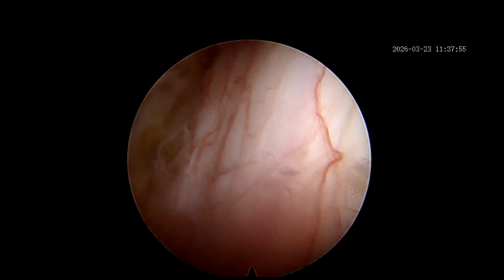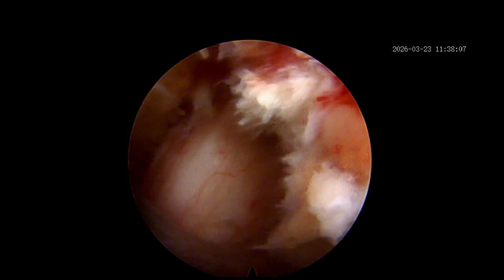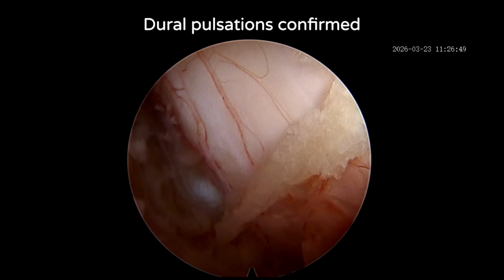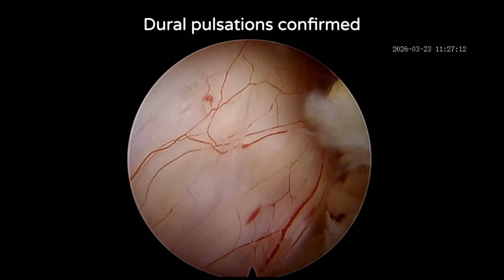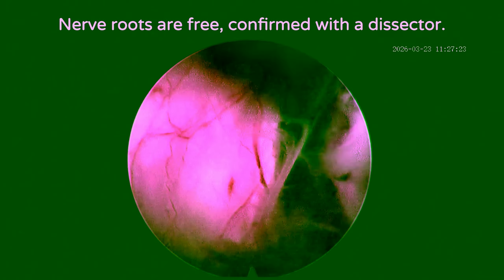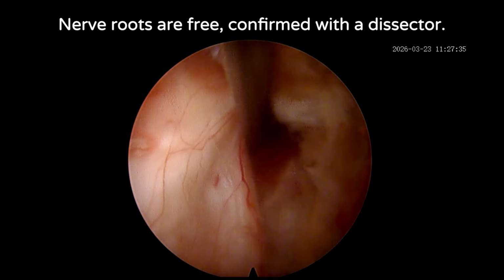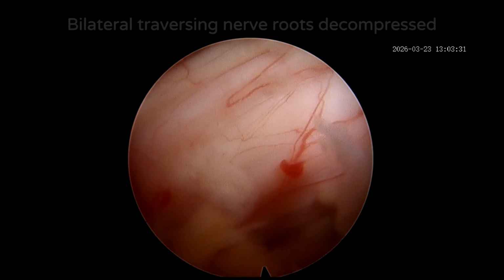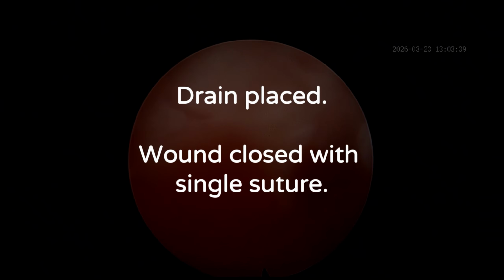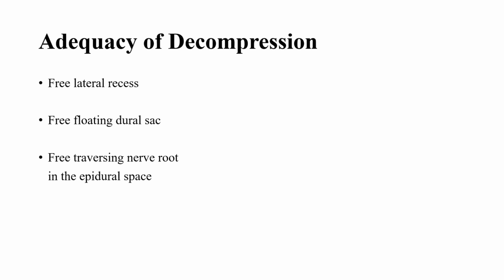It is really very important to achieve the hemostasis, and in this way we can appreciate we have good dural pulsations and complete ligamentum flavum has been removed. Nerve roots are absolutely decompressed on both the sides. We can appreciate the free traversing nerve root going inside, going down, and after that we can place our drain and with a single suture we can close the wound. So this is a typical lumbar decompression endoscopically.